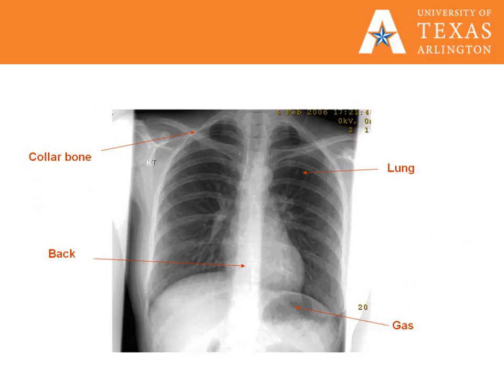Here is a chest X-ray with structures identified: the collarbone or clavicle, lung, spinal column, and the air bubble or gas in the stomach in the left upper quadrant of the abdomen.